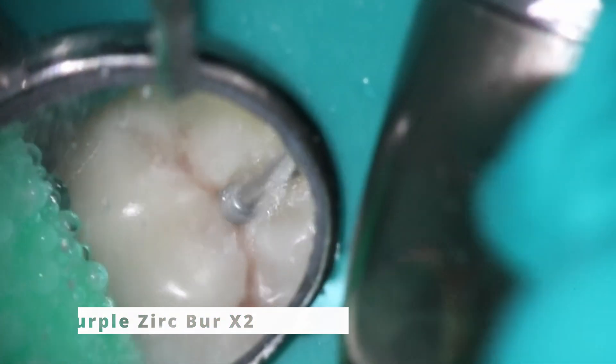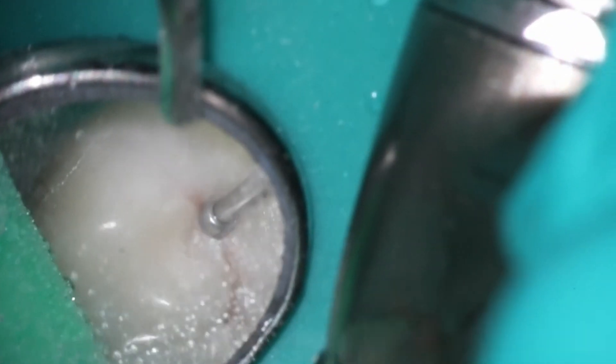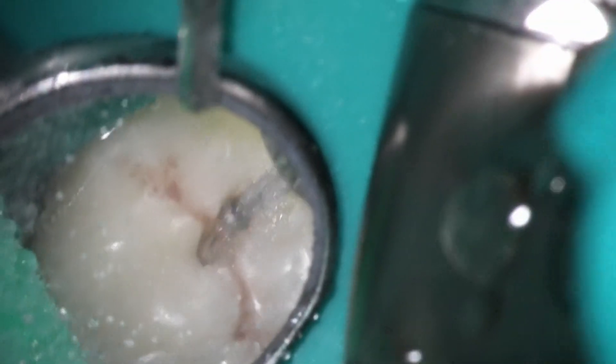I started off with the air, went to the electric. I've already burned through one burr, and you can see here in a second we're about to burn through another. So I'm going to take a quick aside as you see it heat up and talk about why that is.